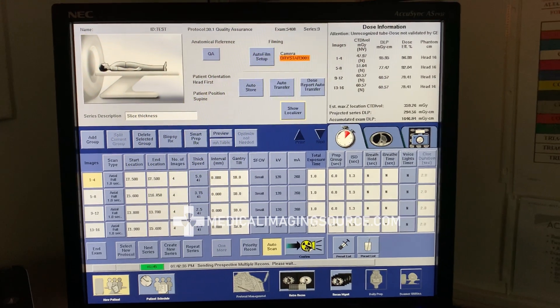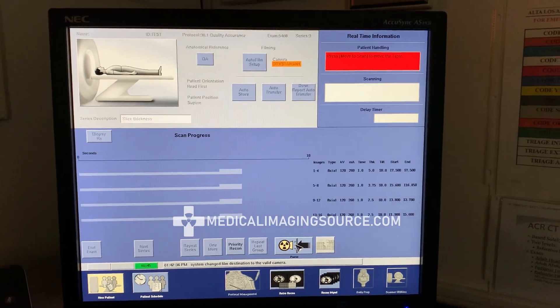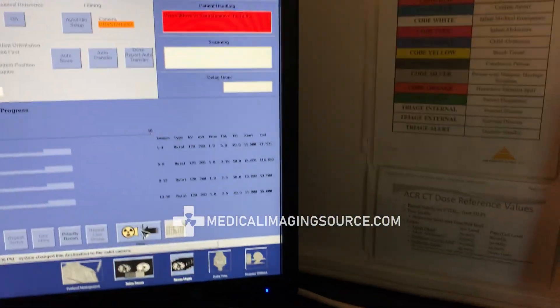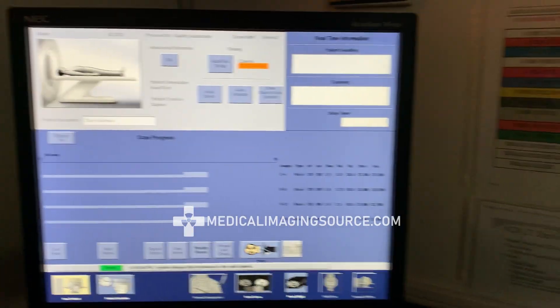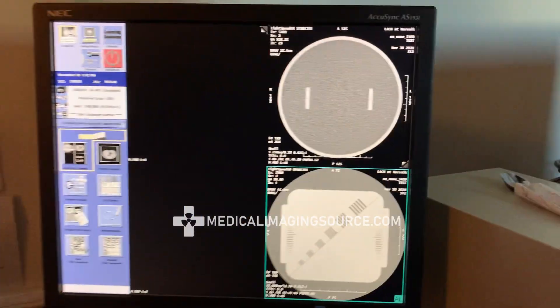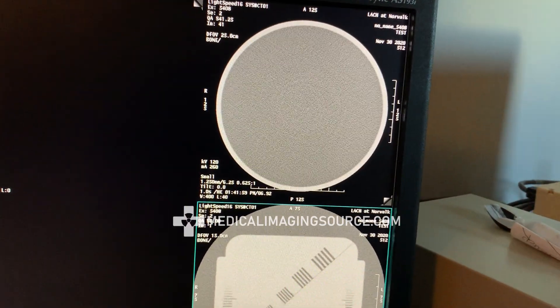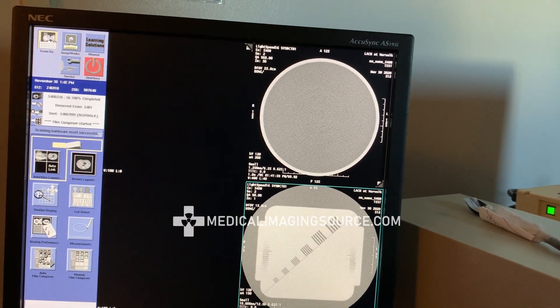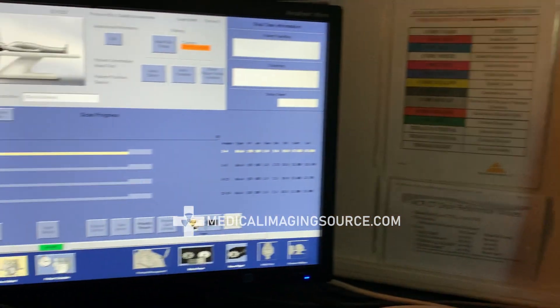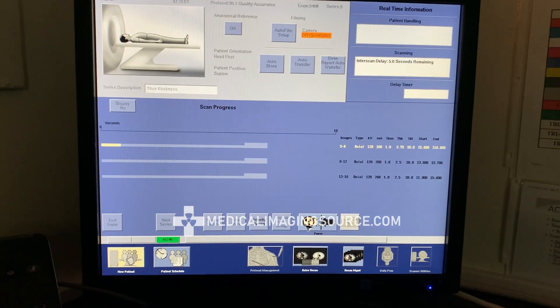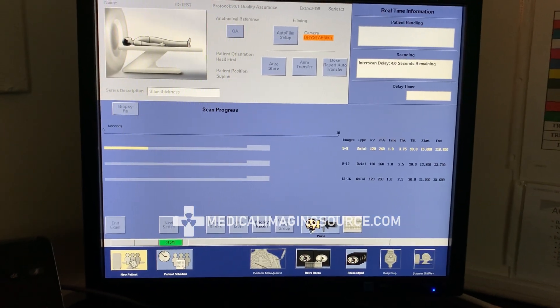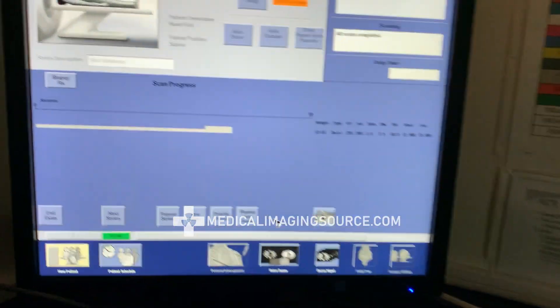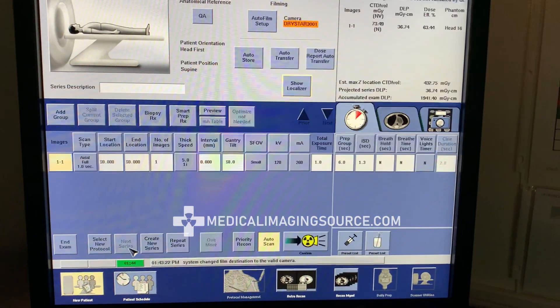Every series has a different purpose — one might be to measure the water mean value, another might be for standard deviation. Every separate series has its purpose, so you definitely want to run them all and do the proper analysis afterwards. All right, series is complete — let's click on Next Series.